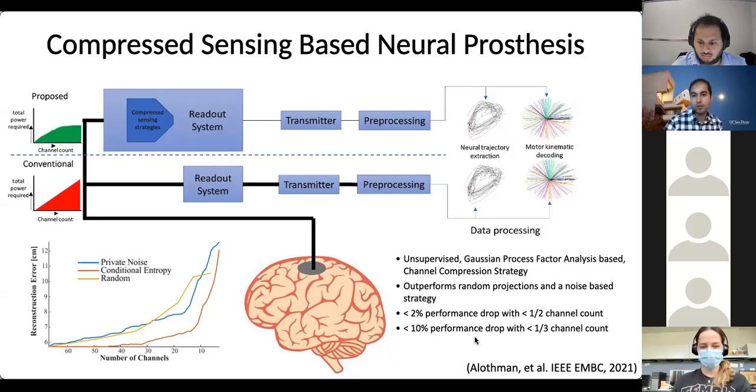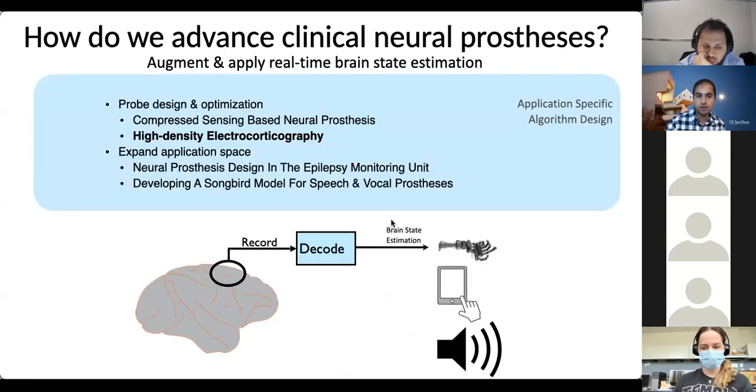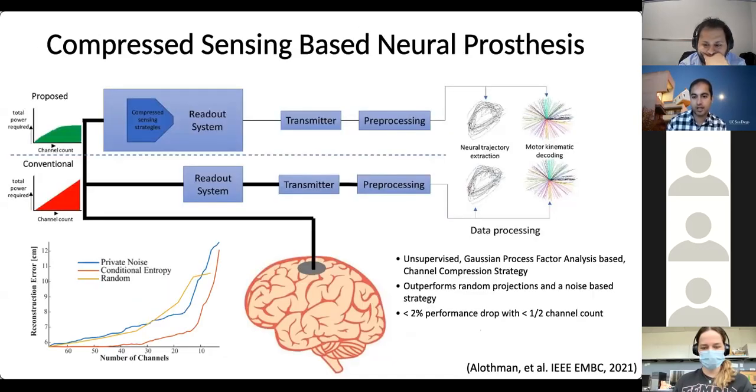Now, you might be wondering, why don't we just run the entire decoder and get kinematics out on the other end? Well, there's a tricky problem there, which has to do with generalization. And so by applying these unsupervised techniques, we can get better generalization to new tasks as well as to new task conditions than we would get with a simple supervised technique. Right? We want to sustain our ability to see the dominant neural trajectories while also holding on to our ability to decode kinematics. So if there are any questions about that, happy to field them at the end.